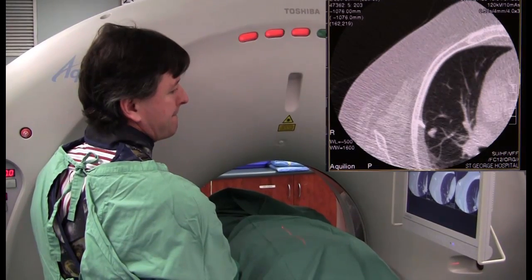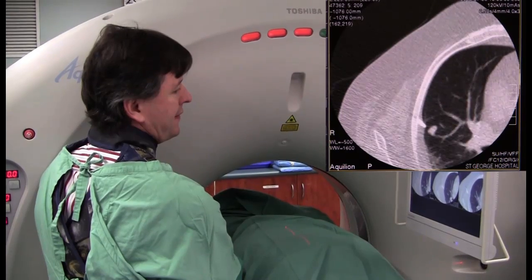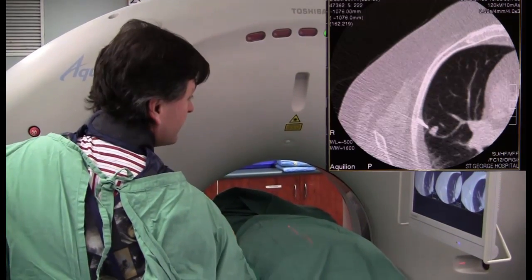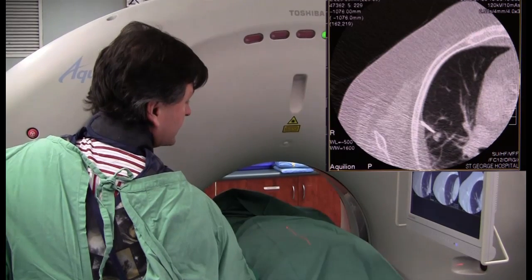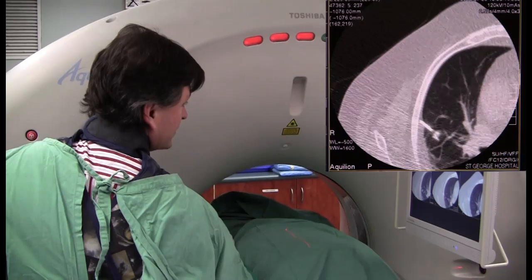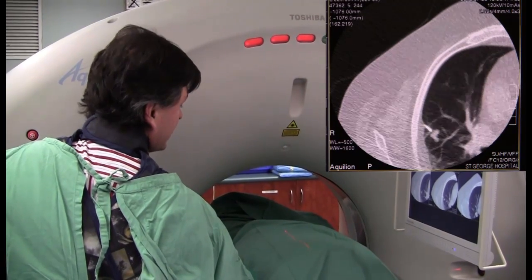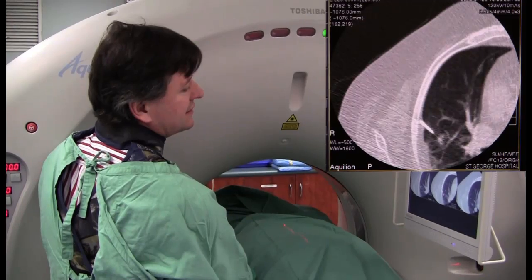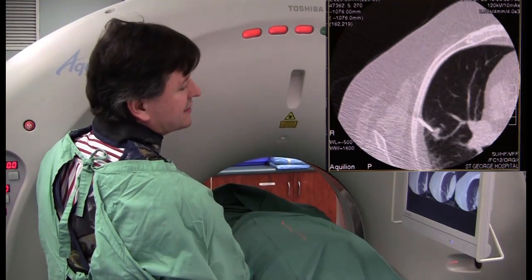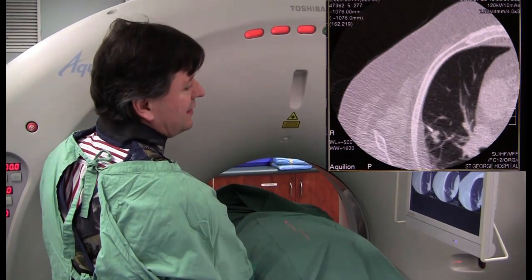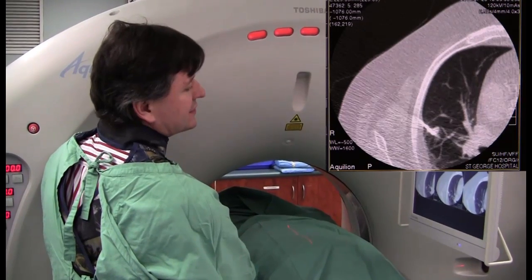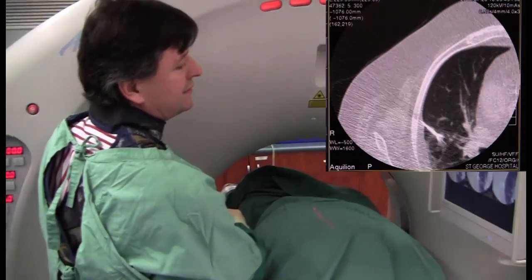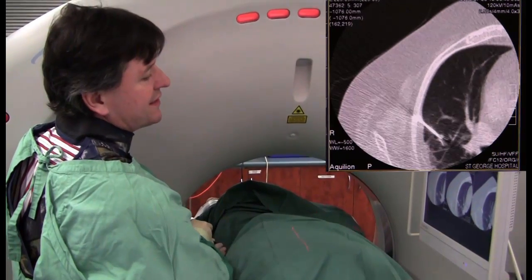My hand is out of the beam. I'm driving underneath the rib — you can see the needle appearing at the top right of that image. I'm just going to move the patient slightly towards me so that it can present the lesion in its entirety. My hand is out of the beam. We've got the needle getting close to the margin of the target. We're just about to cross the pleura. I've got complete control. We'll just keep pulling the Starburst tines through the middle of the lesion.